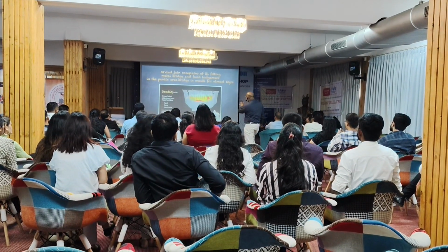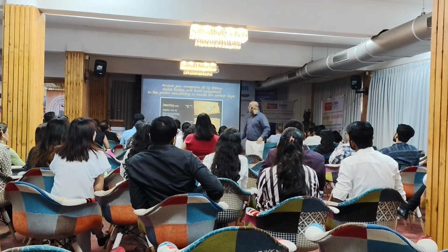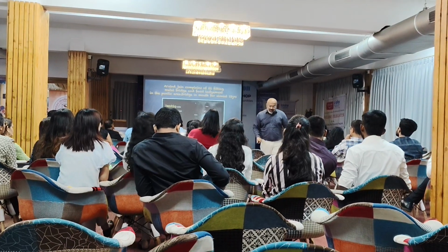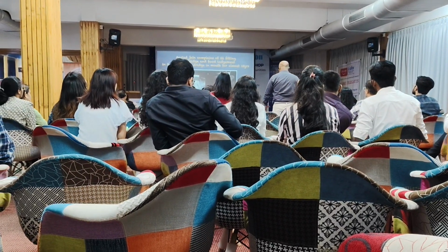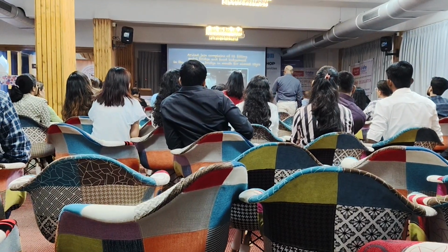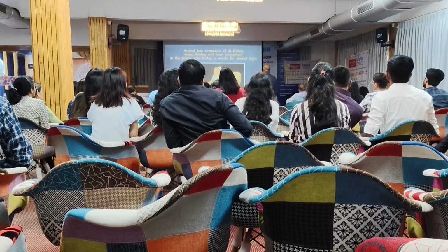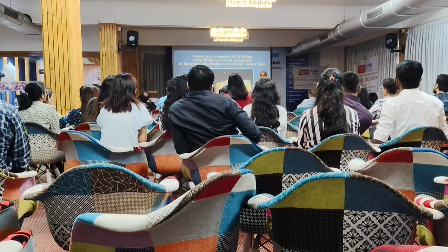This is the solid STL model. This is the CBCT. We superimpose it. We make the planning. I know exactly where my tooth is going to come. This is post grafting. Is the graft being taken up or not? This is the planning. This is the guide fabrication.